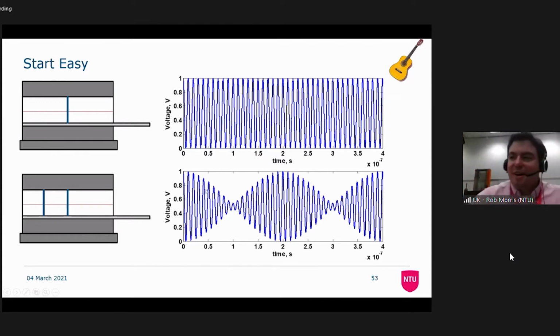Now, the reason that I say this is because this is one of the things which I certainly found most baffling when I first started MRI. You have all of these signals, and surely if you just add them up, you should see all of the signals which you had before.